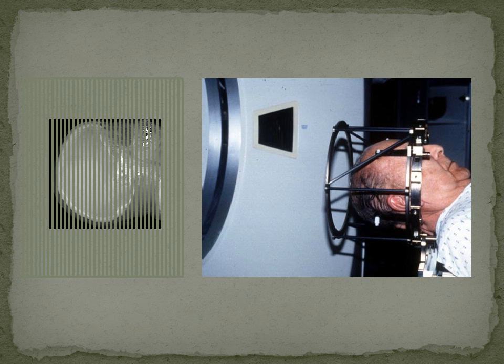Okay. The other thing that you have to be careful about is the scanner itself. We tend to spend a lot of time down in CT and MR with the patient scanning and making sure that we've got everything lined up properly.